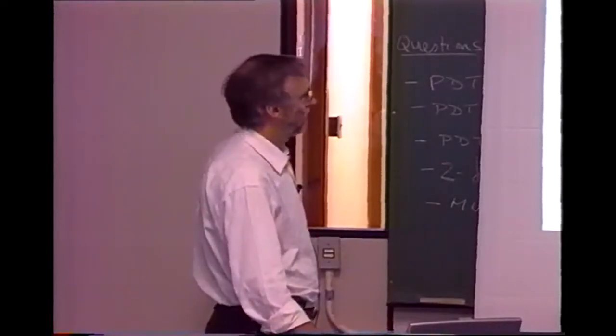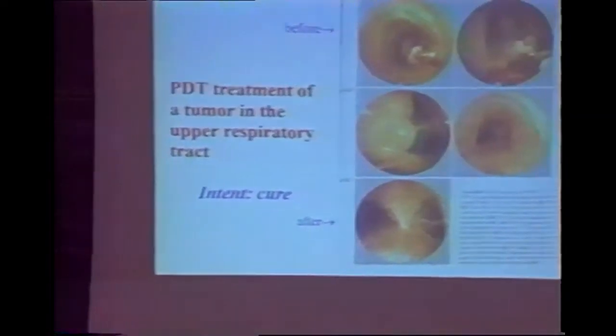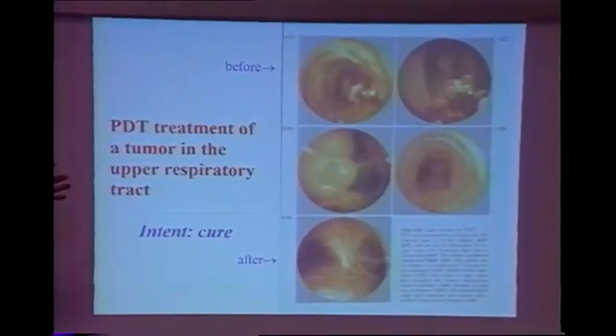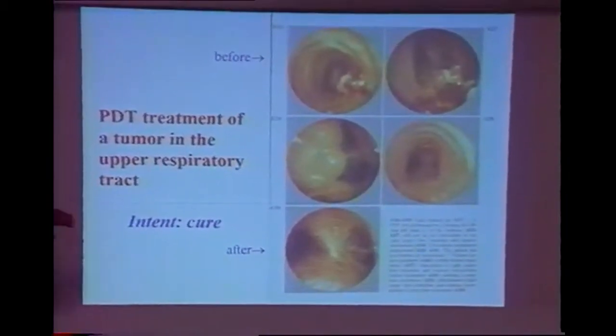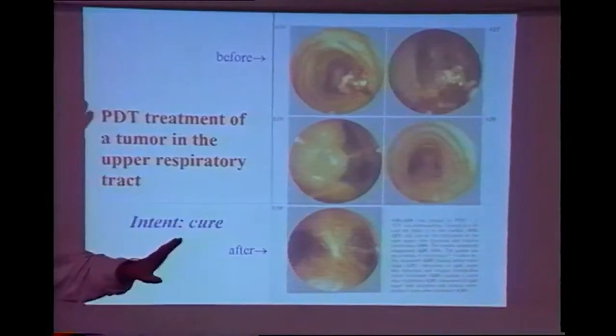In the United States. I showed you this before. It's just the treatment for cure. The previous case was palliation. This is cure. This is 5 years later, no disease. PDT is the only treatment.